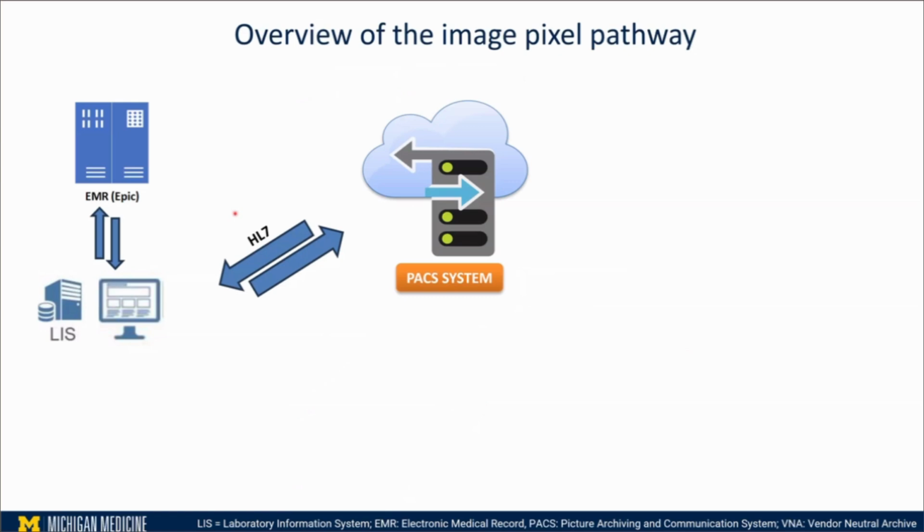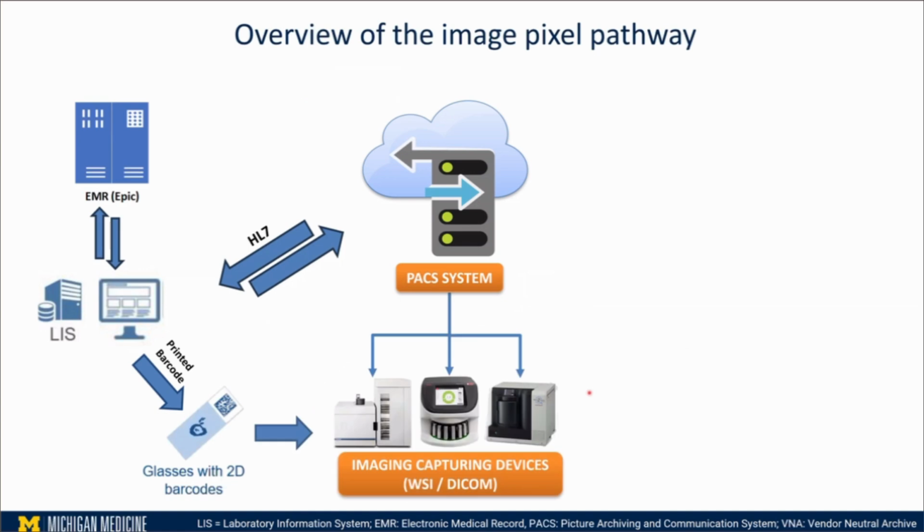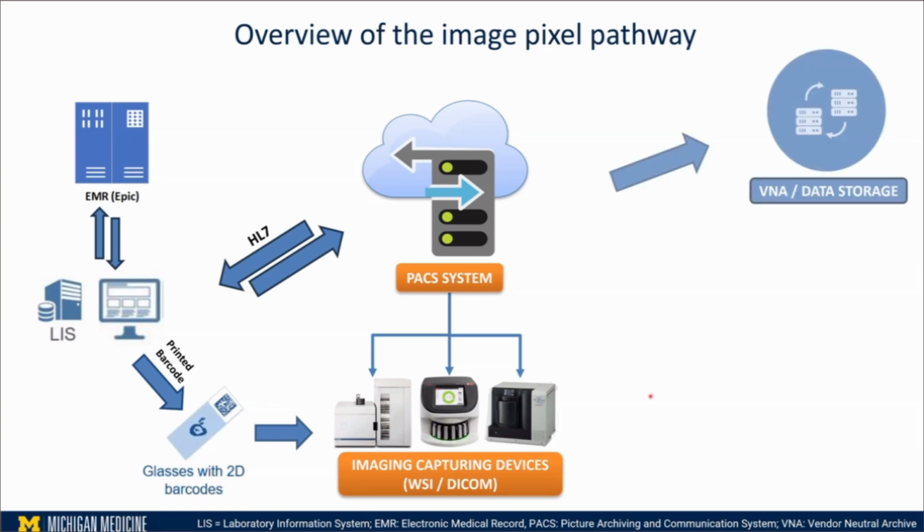What are those criteria from all these HL7 messages that we need to receive from the LIS to have seamless integration? Definitely, we make sure that the quality of the barcode labels and everything is really pristine, because otherwise you're going to struggle picking those slides, and you end up with all these slides that may be scanned, but we couldn't match all the barcode criteria with the lab information system.